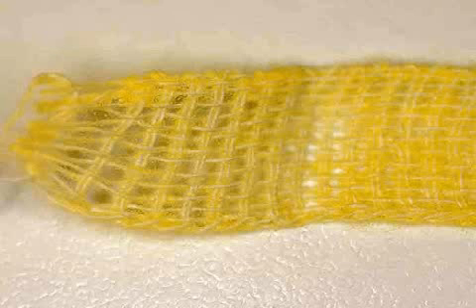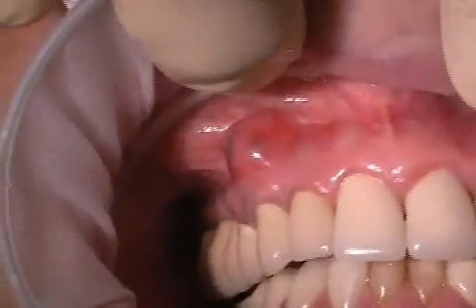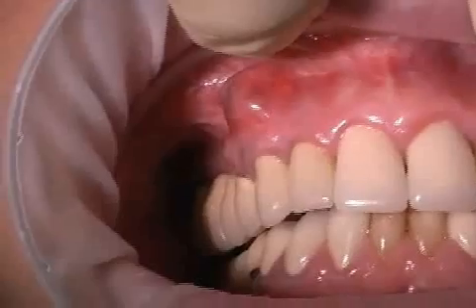The yodoform strip is a textile piece that is soaked in yodoform powder. In dentistry, the yodoform strip is used as a drain and or wound cover.